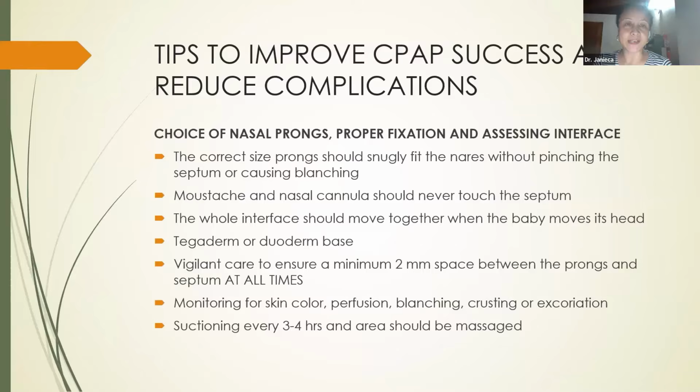It is very important that we care vigilantly so as to ensure a minimum of 2 millimeter space is always there between the prongs and the septum. As we have discussed earlier, the skin is very sensitive in the newborn, so frequent monitoring for skin color, perfusion, blanching, crusting or excoriation needs to be done.